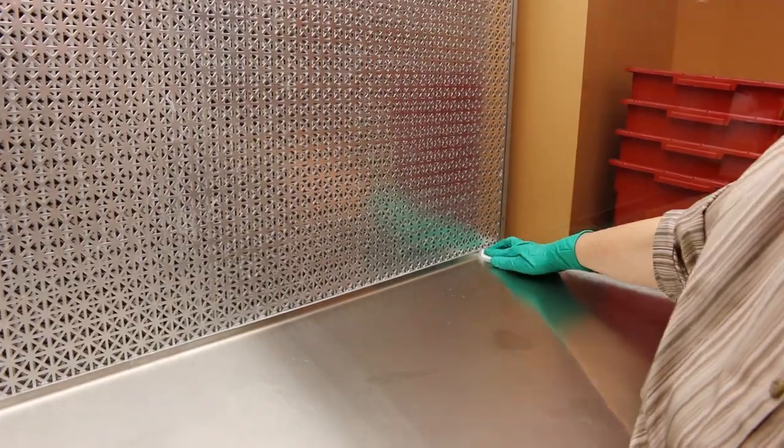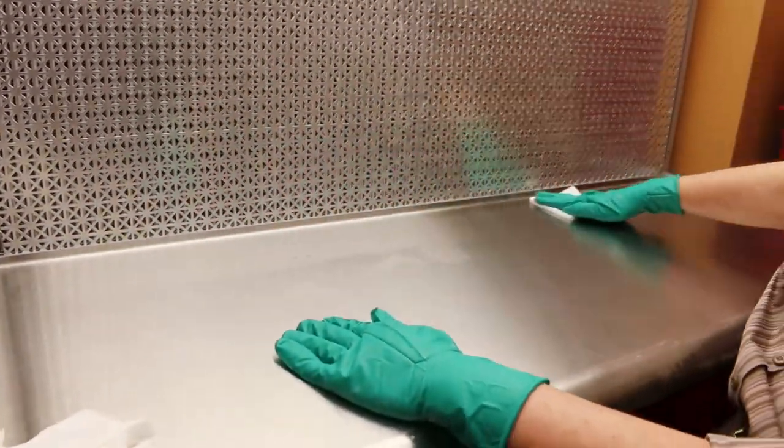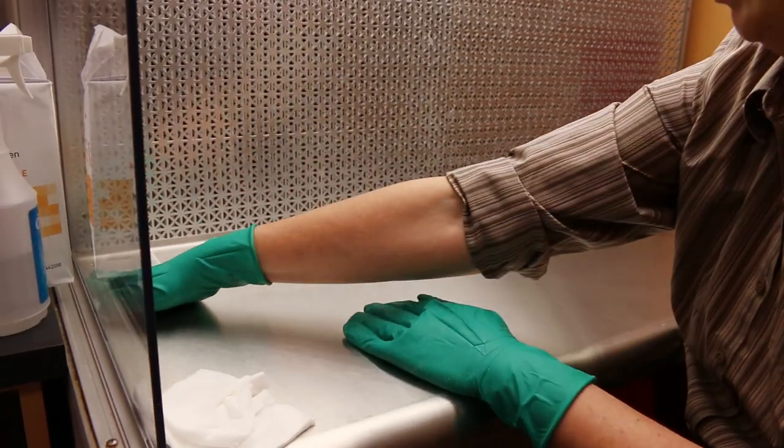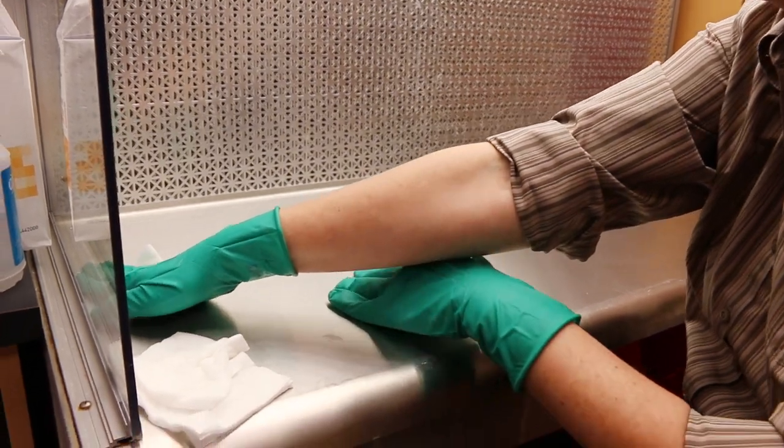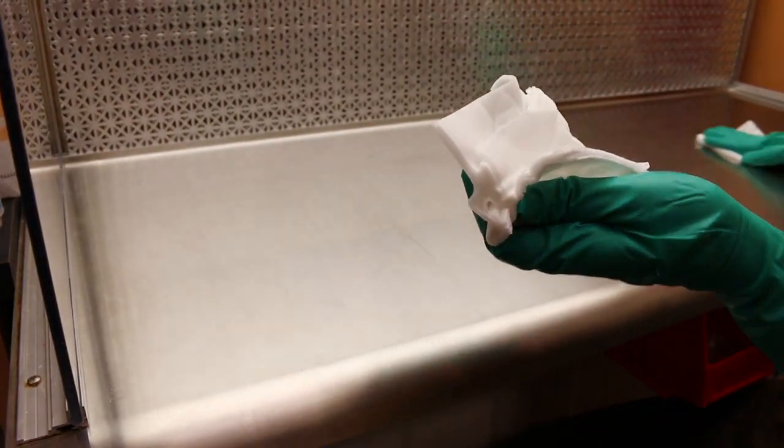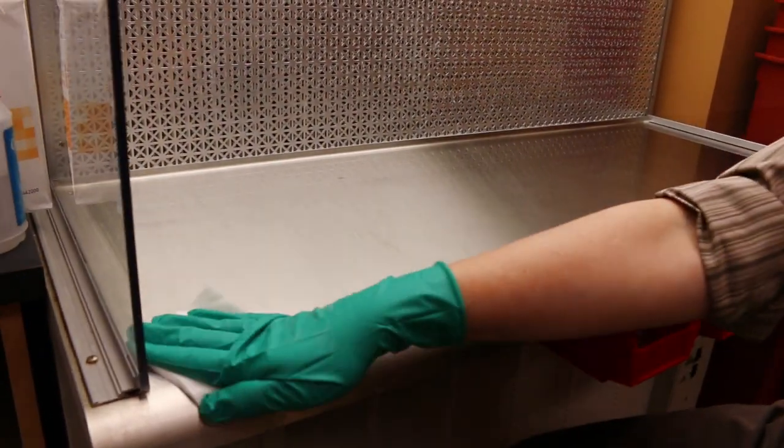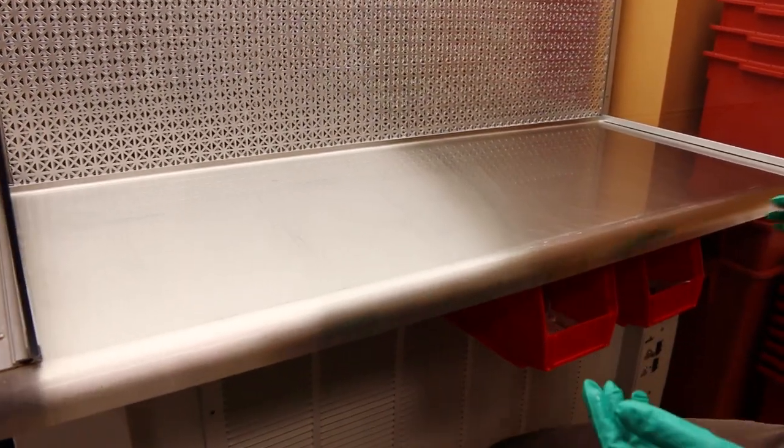And lastly, you would clean the base of the hood with overlapping strokes coming from the back by the filter to the front, and when you get to where you've set your used wipes, you pick those up with one hand, and then you come out of the hood. That is complete cleaning of the hood.